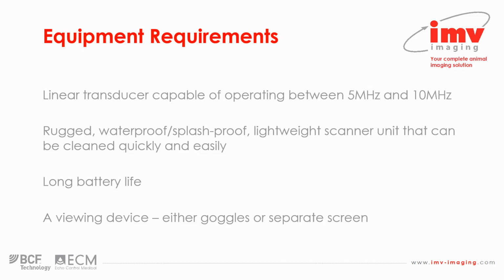There are several products available now, which, as you saw earlier with my discussion of the history of ultrasound, have dramatically improved the lot of the farm vet having to carry the equipment around and use it for extended periods of time without getting backache or what have you, and being able to use that equipment for extended periods of time on farm without batteries running out.